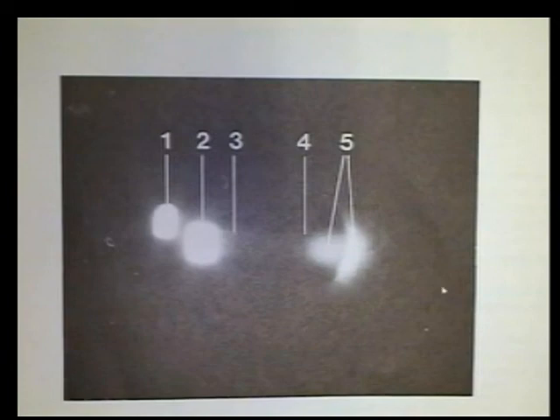The picture we're looking at here is the conical beam hitting the cornea and hitting the crystalline lens. Front surface, back surface, and so forth. Right in between the numbers 3 and 4 here, you can detect a haze. And what that is, is an increase in white blood cells floating in the anterior chamber, an indication there's some sort of intraocular infection or inflammation. But again, this is not something that we typically would use as contact lens fitters.